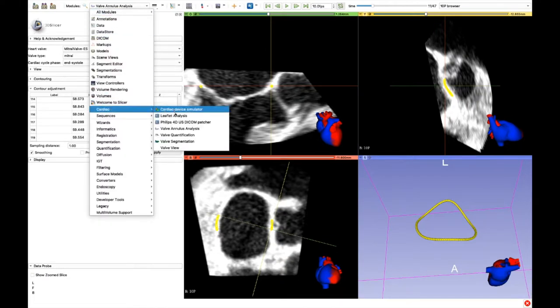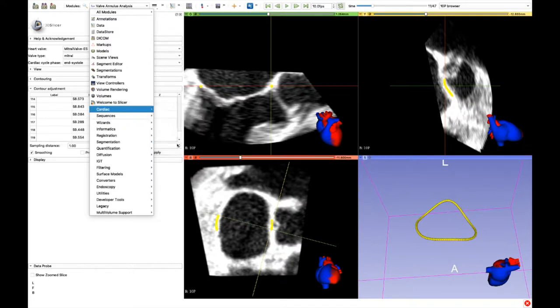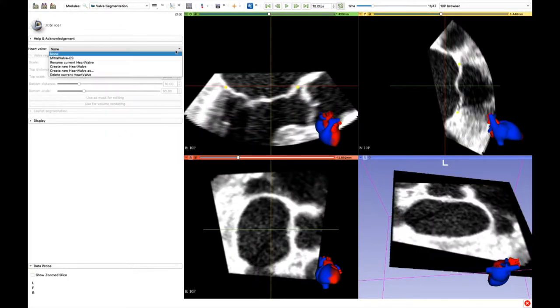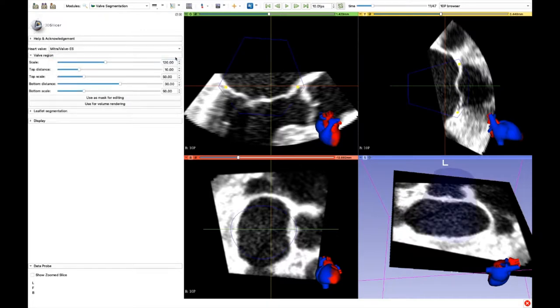Now it's time for leaflet segmentation. First, an editing mask shall be created. The closer the mask is to the annulus borders, the easier the segmentation will be.